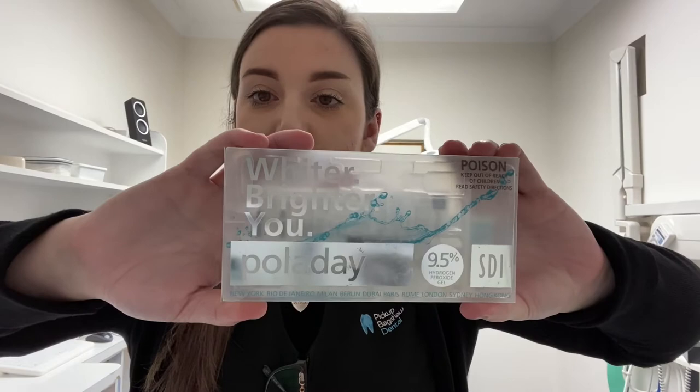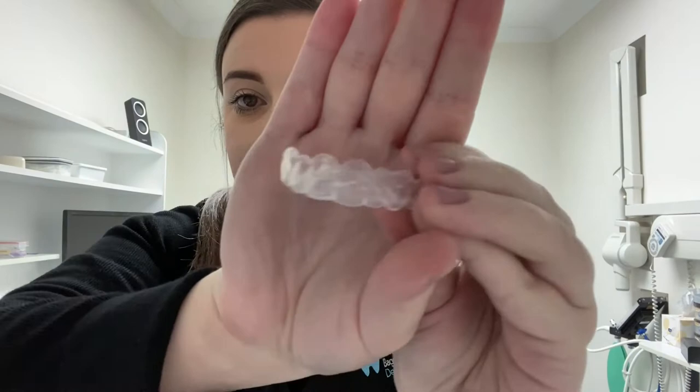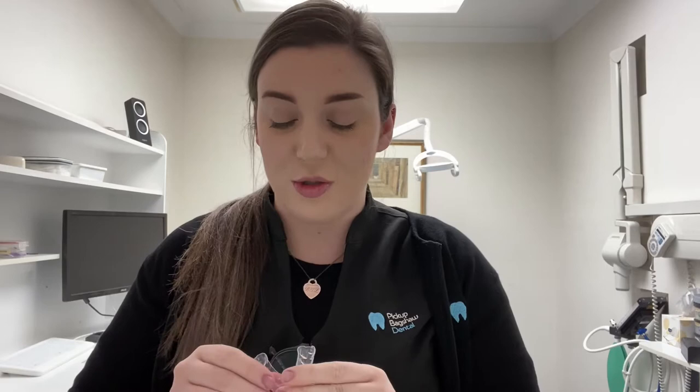When you get your whitening kit, it comes with the take-home trays and some tooth mousse, as well as a kit that looks similar to this — the Poladay Whitening Gel, 9.5% hydrogen peroxide gel. It is relatively strong, which is why we give you these trays so they sit nicely and can avoid burning any areas that don't need bleach. There is a tighter space between the tooth and the gum because putting gel on your gums can cause irritation and burns, so you have to be very careful when applying the whitening gel onto your trays.